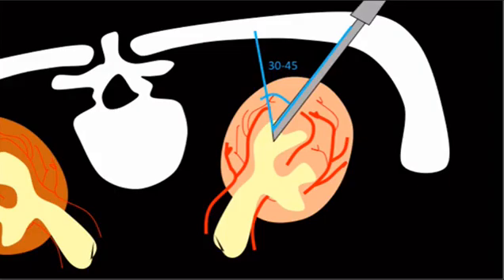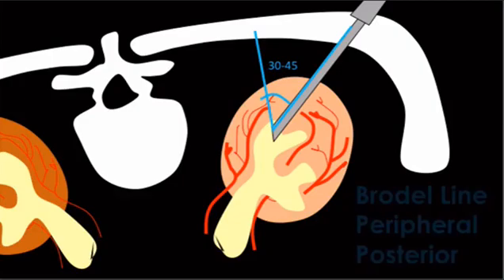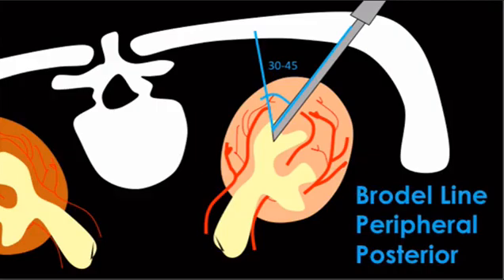And then if you have to take an intercostal approach, obviously you want to avoid going inferior to the margin of the rib to decrease the risk of an intercostal artery injury, that neurovascular bundle. And if you have the choice, it's much better to go T11, T12 relative to T10, T11 for avoiding lung and liver and spleen, those kinds of things. So lower is better. Avoid the inferior margin of the rib if you have to take an intercostal approach.